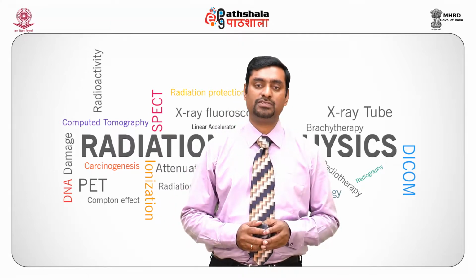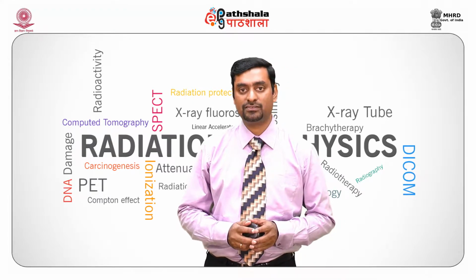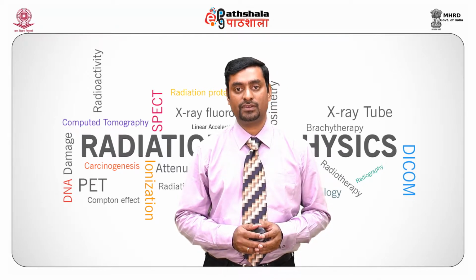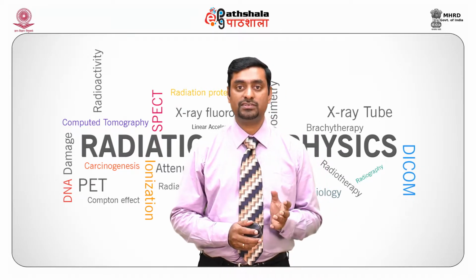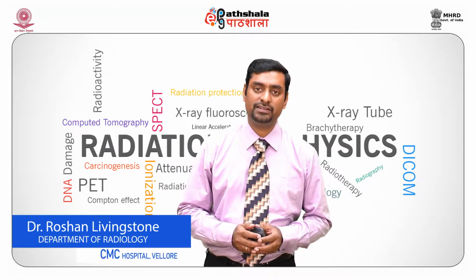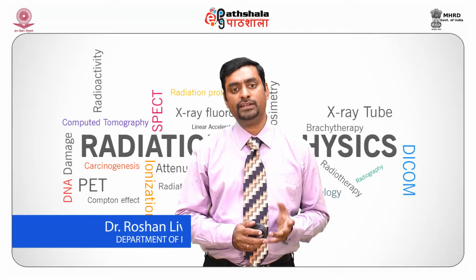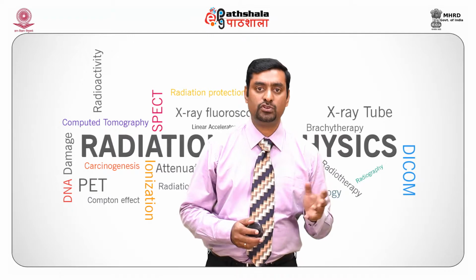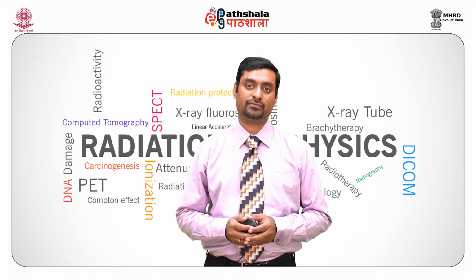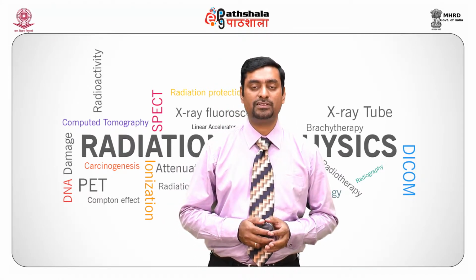Hence, for mammography purposes, we need high resolution CR cassettes. Hence, the packing factor for the phosphor which is used for CR should be very high. The image resolution we are considering for mammography is about 100 microns. Hence, CR readers come with 100 micron pixel size. In a dual side reading CR reader, the resolution can go up to 50 microns. It is very good for image quality. The cost of these CR readers is less than flat panel detectors.